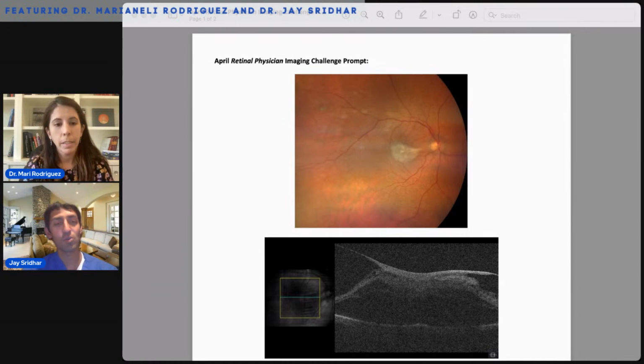I think those are great points. I think there's two other components of this case specifically. Number one, the presence of the combined vitreomacular traction with ERM actually makes me feel better about taking this patient to surgery, because let's say something happens or the peel is really difficult and that membrane doesn't want to come off. Even if you just get the hyaloid off of it, this may get a lot better, right? So the chances of success are actually a little higher here.